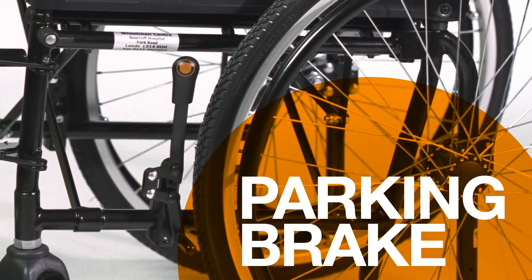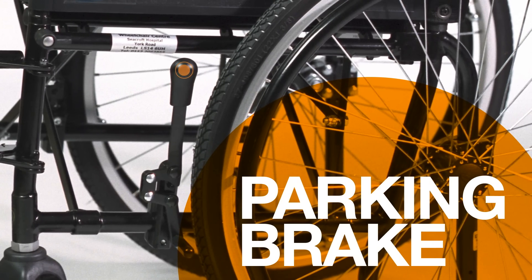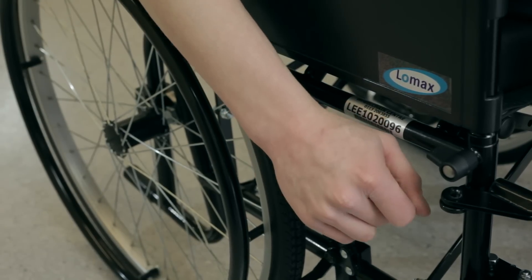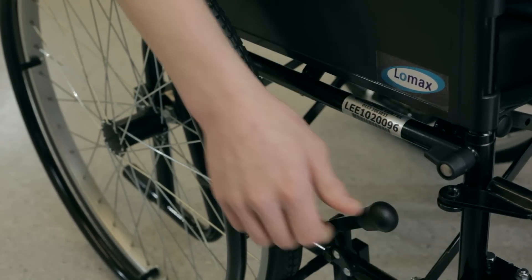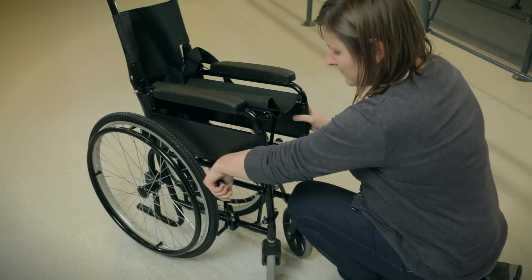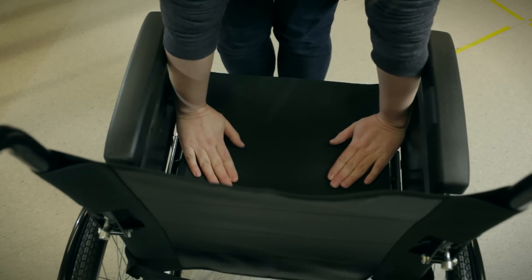There are parking brakes at both sides of the chair. They stop it from moving by securing the wheels. They must always be applied when getting into and out of the chair, to prevent it from rolling as your body weight transfers. The brakes should also be used when folding the wheelchair, opening it, or lifting it into a vehicle.